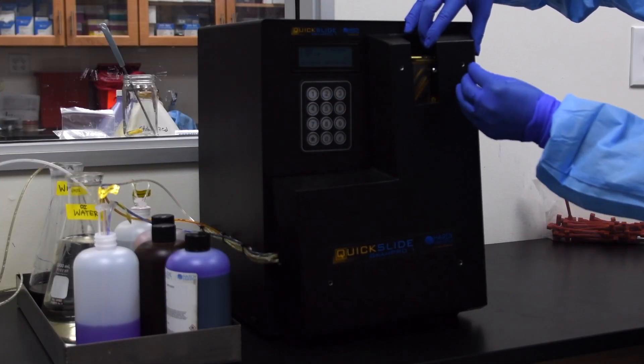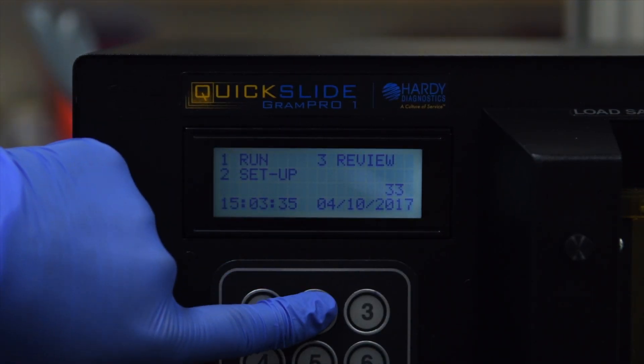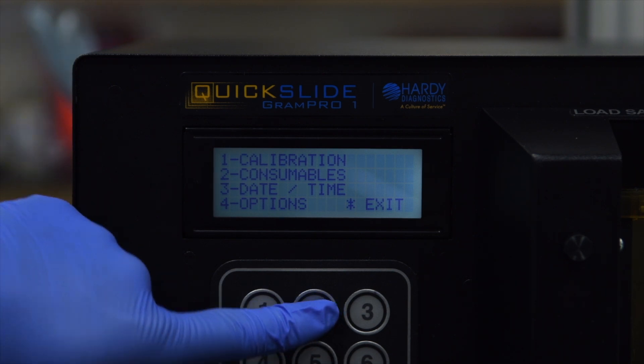Now replace the front panel. From the main menu, press 2 on the keypad to select Setup. Press 2 to select Consumables.